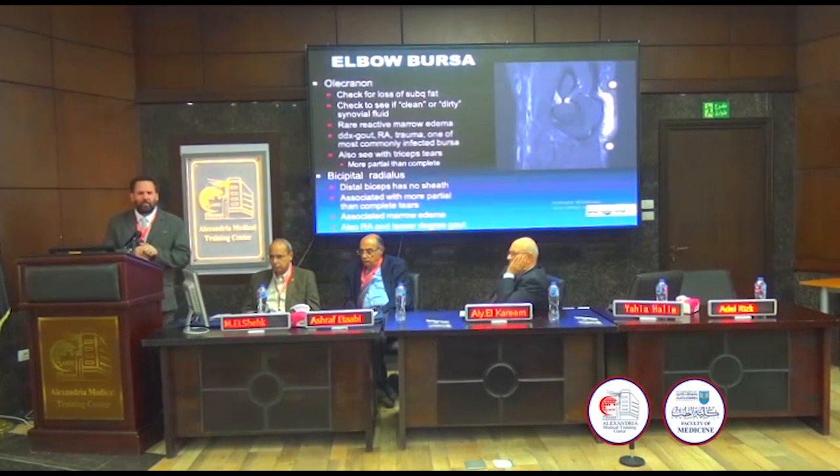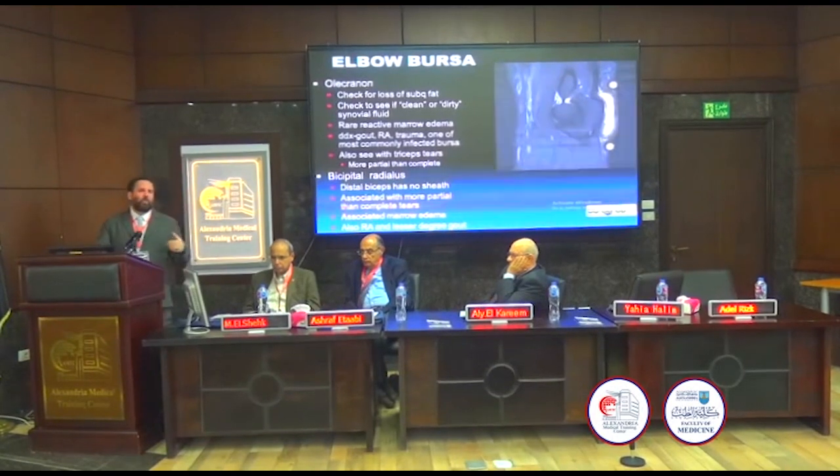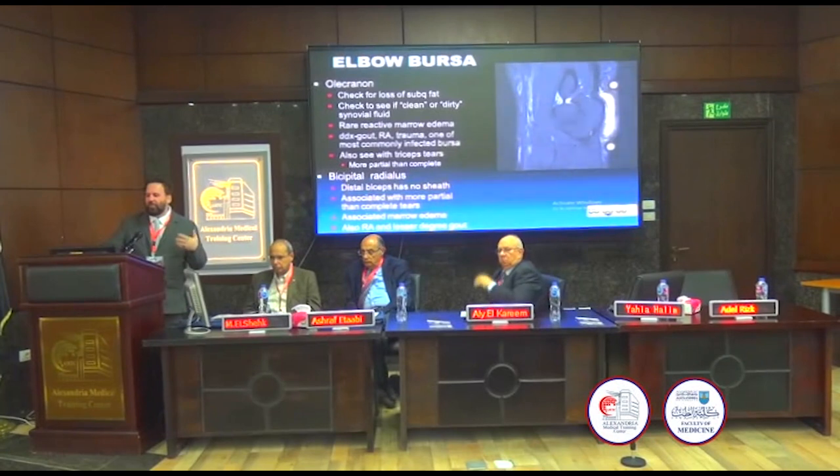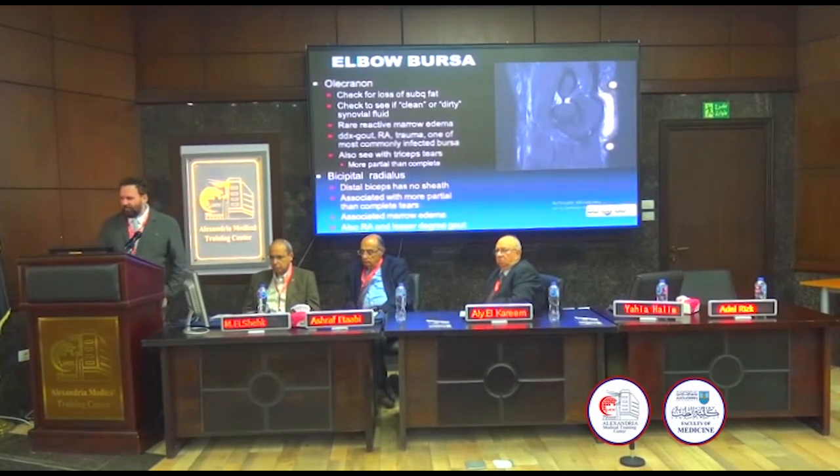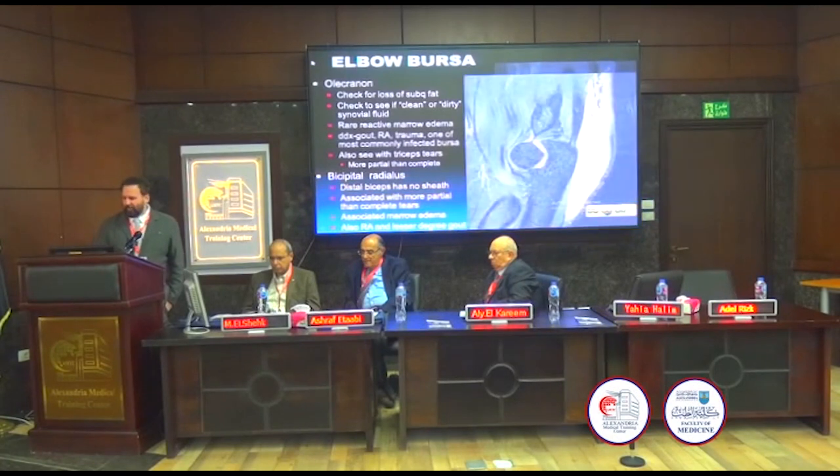Good sign. And just like in joint fluid, we want to see clean and dirty fluid, we want to see clean and dirty bursal fluid. And that will help us on a differential diagnosis. So if you look here, this is pretty clean fluid, right? It's pretty bright on T2. Right? Certainly as bright as a vein is. Pretty homogeneous, no visible synovium. So this will be bland bursitis.